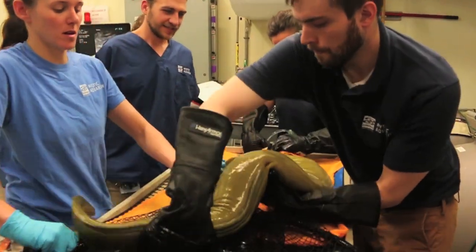On the bottom level there is a sump which contains more of the system water with the sedative in it, and a pump with a hose that we run up to the top portion and put into the animal's mouth so they continue to breathe and remain sedated throughout the procedure.